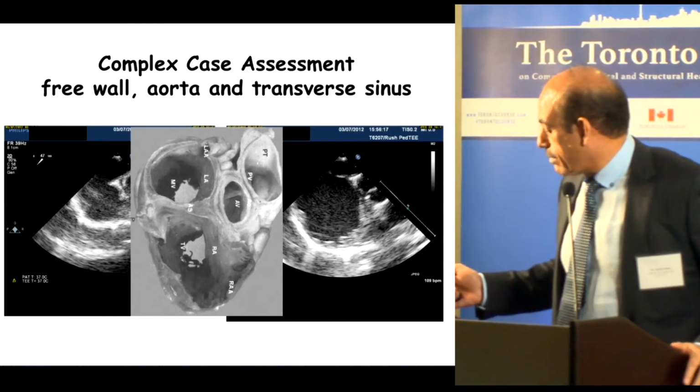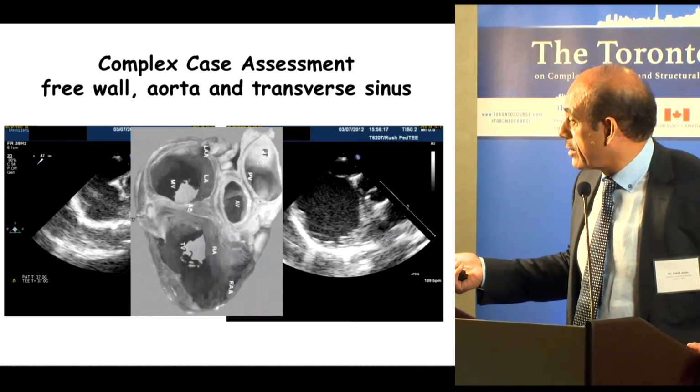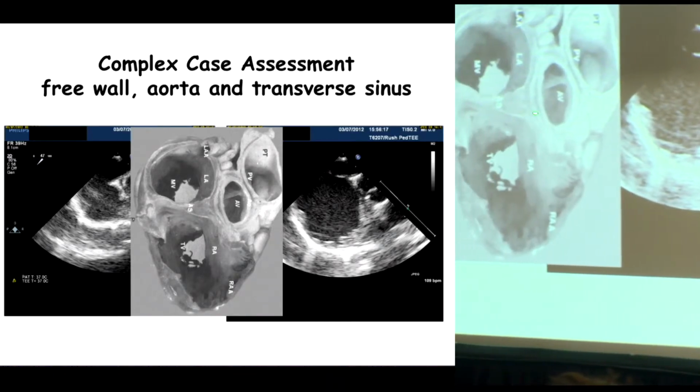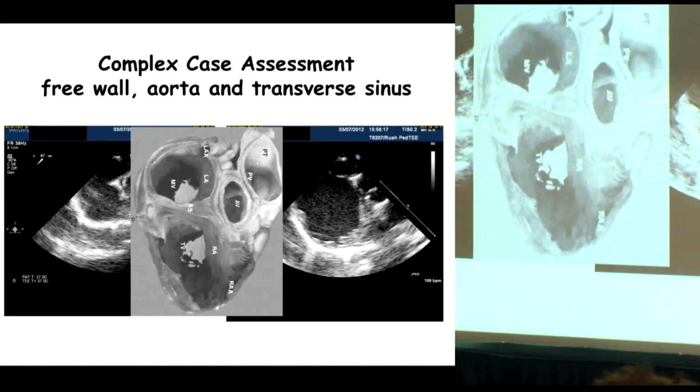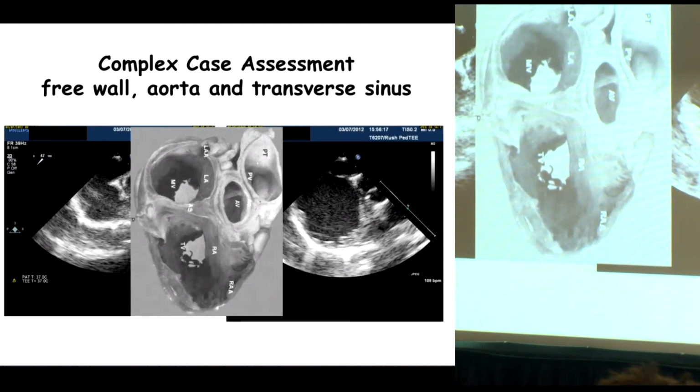So keep in mind this area is where the right disc will continue to pound on the atrial free wall, ultimately will tear the atrial free wall, and if it's big enough or tilting enough, it's ultimately going to the aorta and the patient will tamponade out.